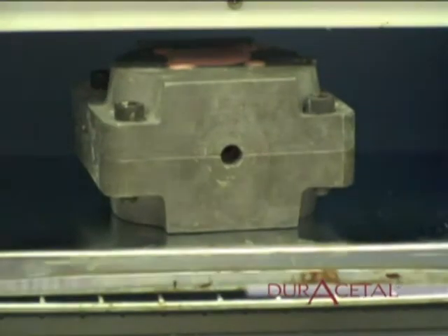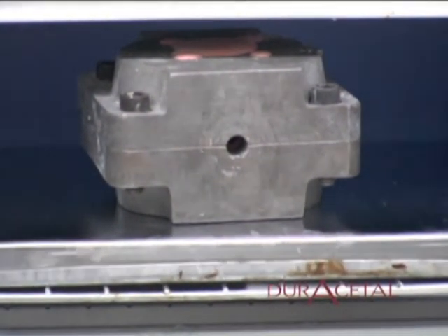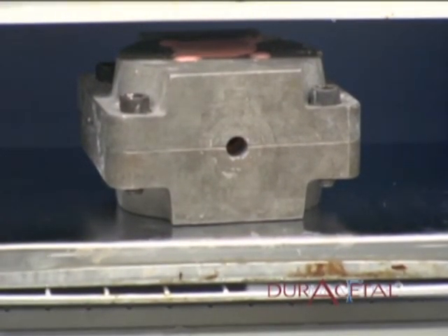Once the flask has cooled down and before it is time to inject, set an oven for about 250 to 300 degrees Fahrenheit and preheat the flask for 15 minutes.